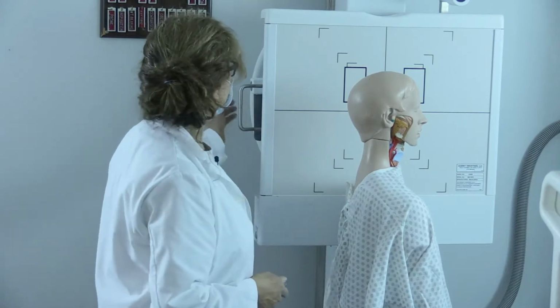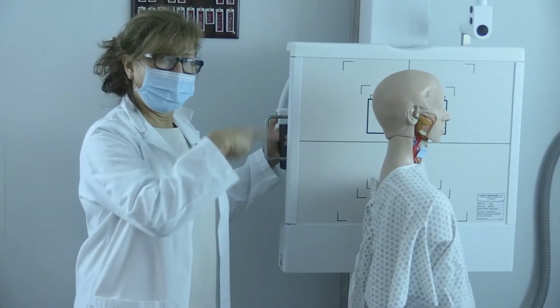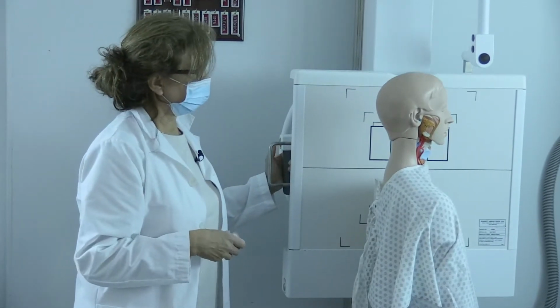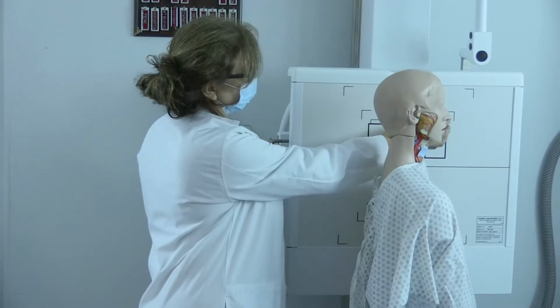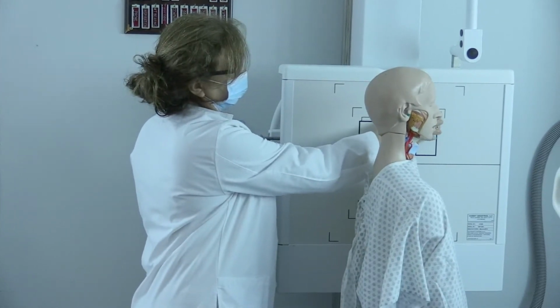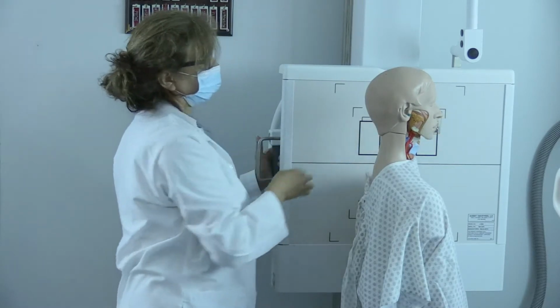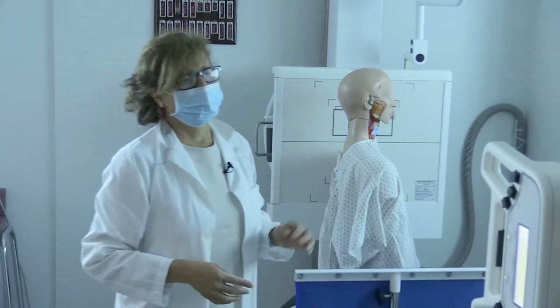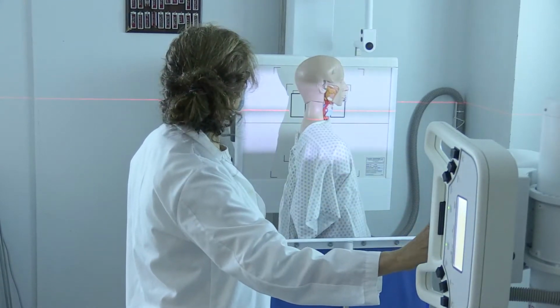I'm going to use an IR of 10 by 12 lengthwise. Place my marker in the collimated field. And I like to place my marker right there. I'm going to collimate to 10 by 12 as well.